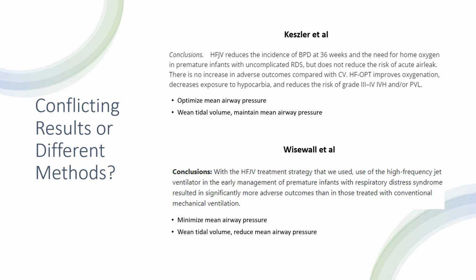Kessler examined the effects of jet ventilation for the treatment of respiratory distress syndrome in preterm infants who received surfactant and found no increase in morbidities and significant reduction in the development of bronchopulmonary dysplasia. Other studies by Engel et al. and Davis et al. found improvements similar to Kessler along with no increases in mortality. When taken at face value or only by reading the abstract, some providers developed the belief that the jet ventilator had no benefits or increased the risk for harm.